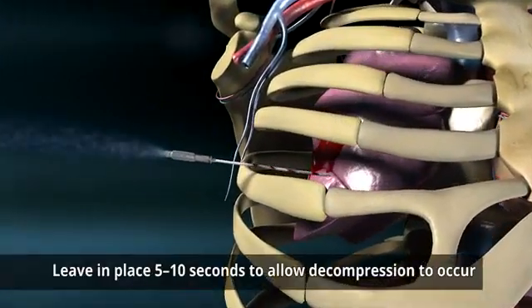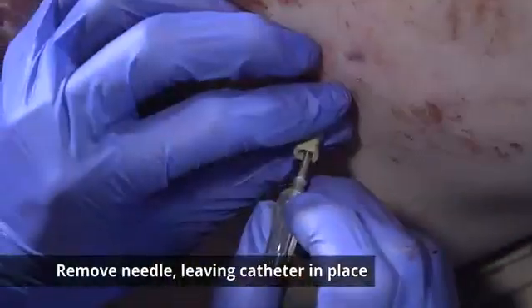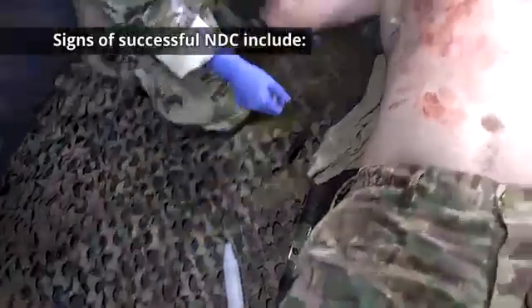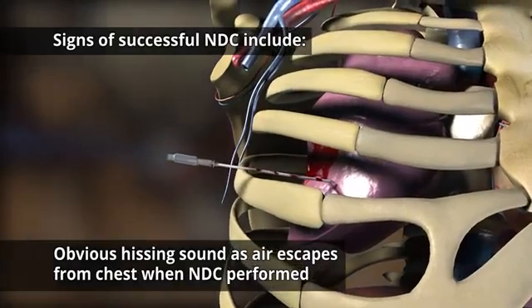Leave the needle catheter in place for 5 to 10 seconds to allow decompression to occur. Then remove the needle, leaving the catheter in place. Assess for successful needle decompression. Signs of success include an obvious hissing sound heard as the air escapes from the chest when NDC is performed.